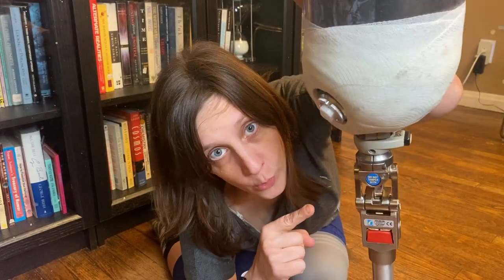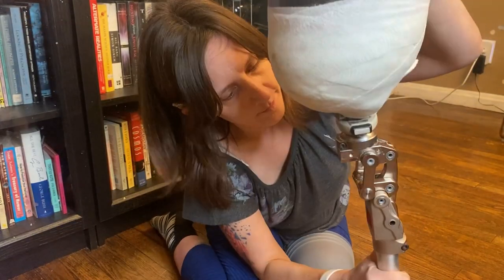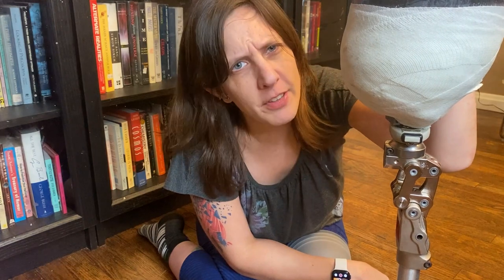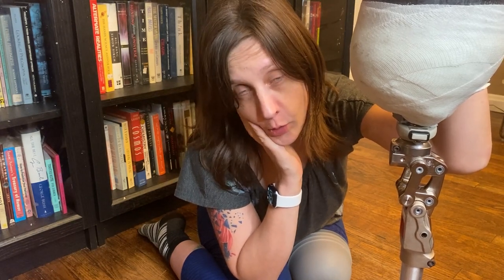This is an Ossur Total Knee. It is a hydraulic, geometric, polycentric knee — there are a bunch of other words used to describe it that I'm kind of forgetting right now. It's a mechanical knee, so it's not a microprocessor knee. You don't need a charger for it. It's just the knee right here.